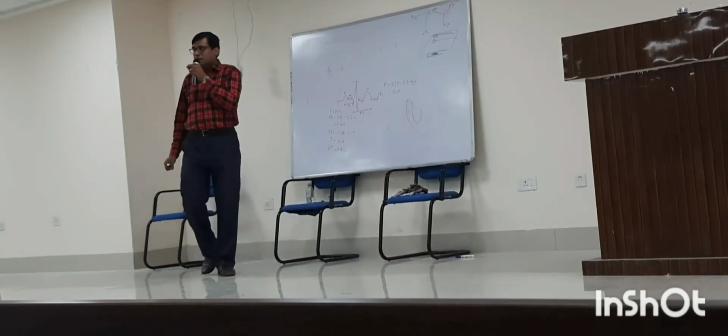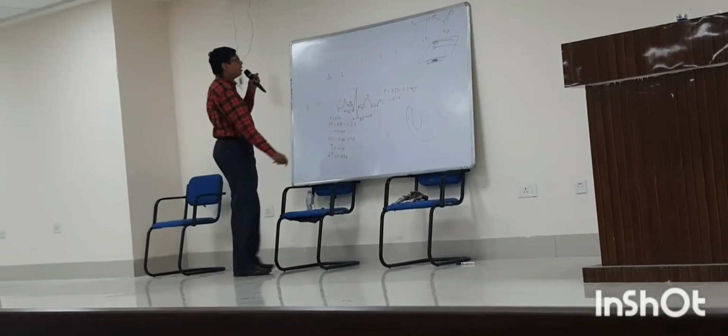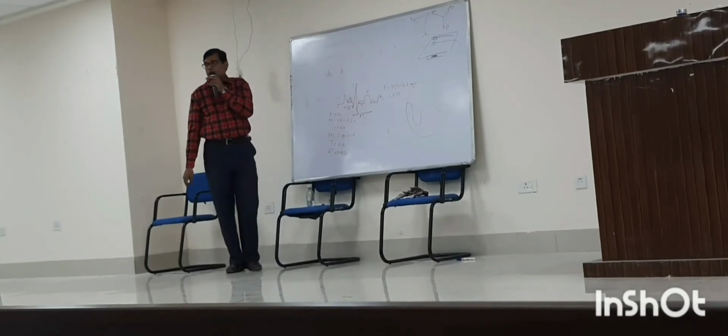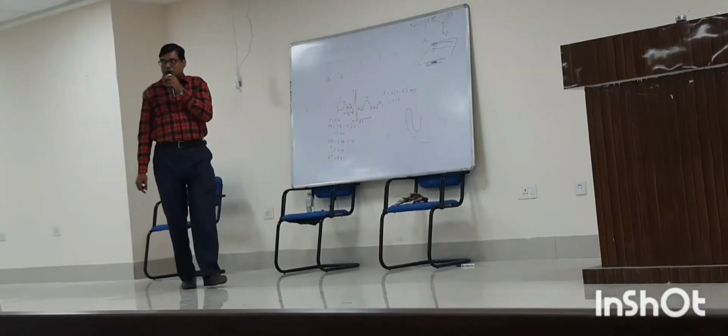Here I am considering the QRS wave. There is some endocardial necrosis. Look at the board. There is some endocardial necrosis.